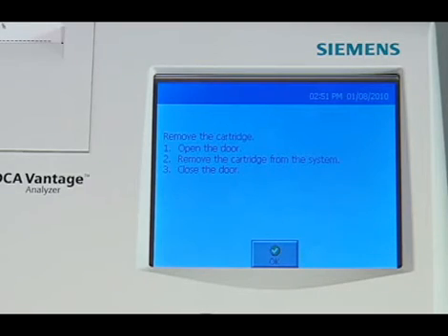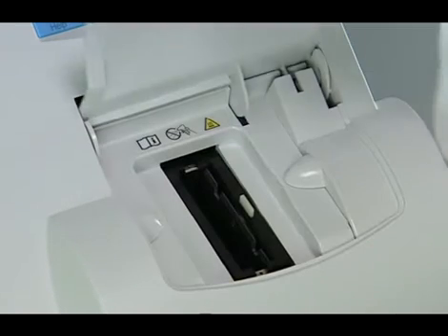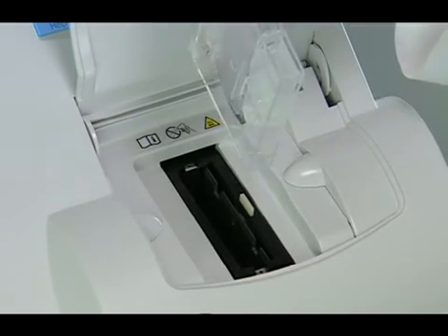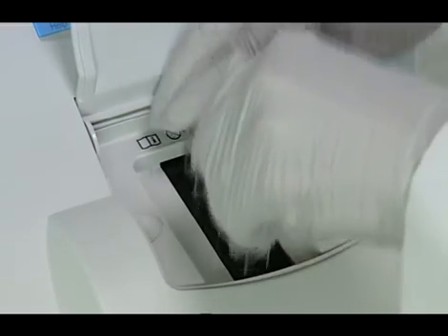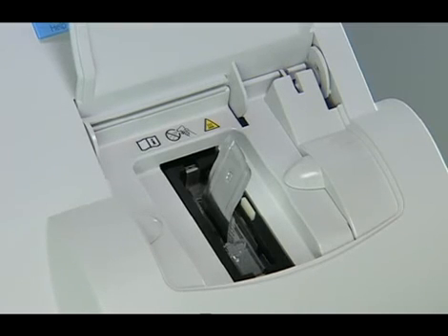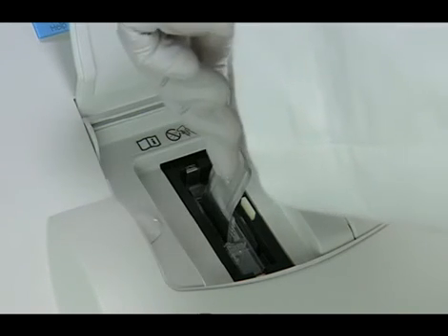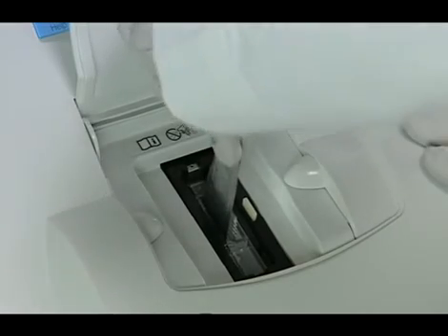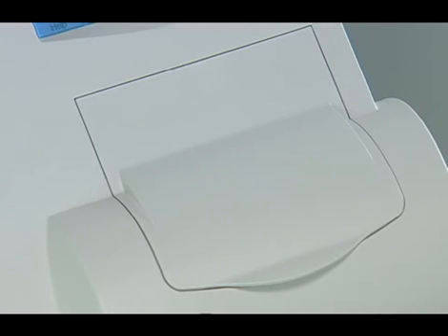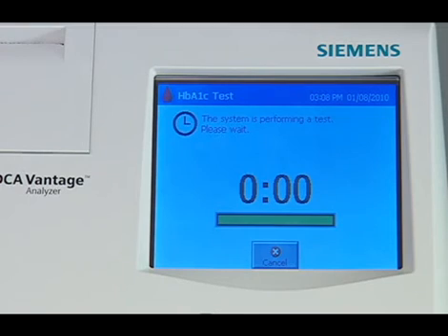The final step is to insert the reagent cartridge into the DCA Vantage Analyzer. Open the cartridge compartment door and hold the reagent cartridge so that the barcode faces to the right. Insert the reagent cartridge into the cartridge compartment until a gentle snap is heard or felt. Note: the cartridge is designed to fit only one way into the system — do not force the cartridge. Using a smooth, slow, continuous motion, pull the flexible pull tab completely out of the reagent cartridge. Close the door and dispose of the flexible pull tab. The A1C results will be completed in six minutes.